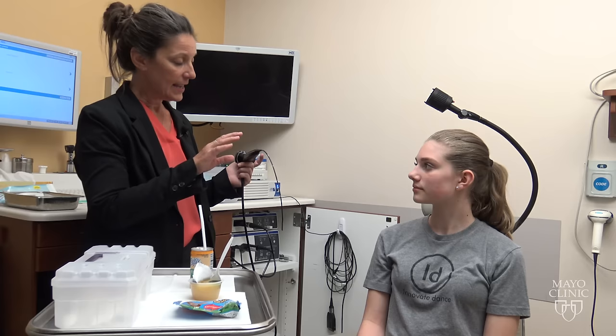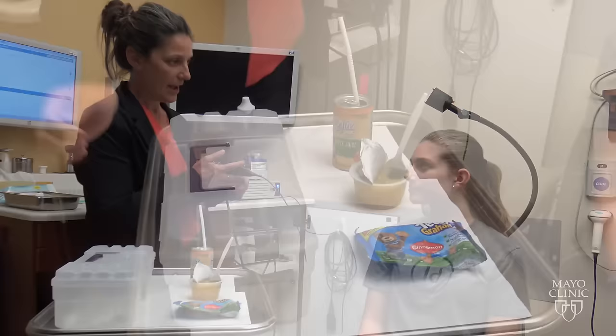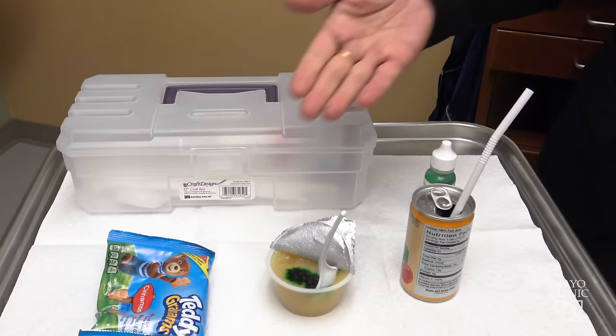We're not in there very long, just long enough to take a look around at the anatomy, give you a couple of things to eat and drink, watch you swallow those and then we come out. The different items we're going to be swallowing — we like to do an assortment of consistencies: a thin liquid, a puree, and then a solid consistency.